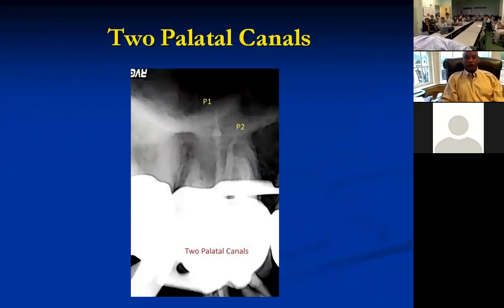So you remember some of those slides that I showed earlier with certain laws that help you determine what to look for and where to look for canals in the pulpal floor. We're looking at the vertices, and then we're also looking at symmetry in our pulpal floor. So we kind of get an idea that there should be an MB2 in this tooth. If we have the MB1 that's way over to the mesial buccal, okay, there are developmental grooves on the pulpal floor, and we just follow our developmental grooves, and there should be a degree of symmetry in that pulpal floor. So we look for that MB2.